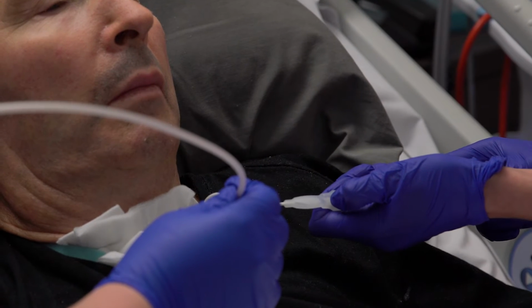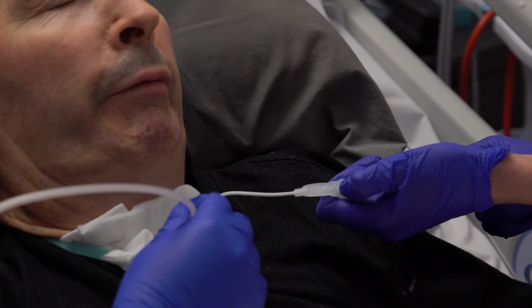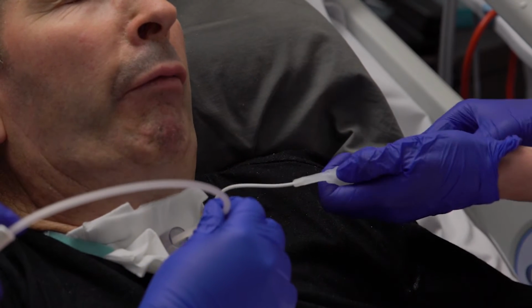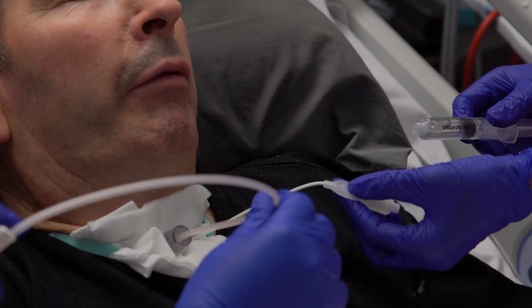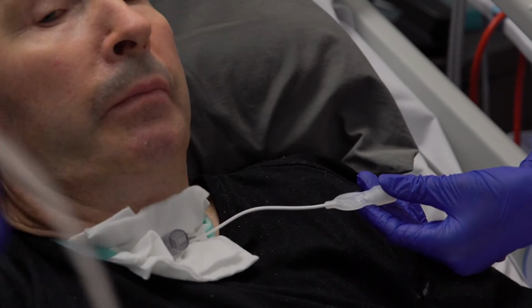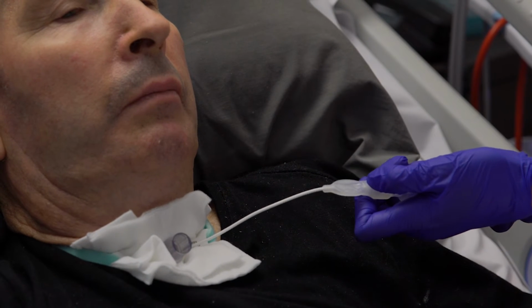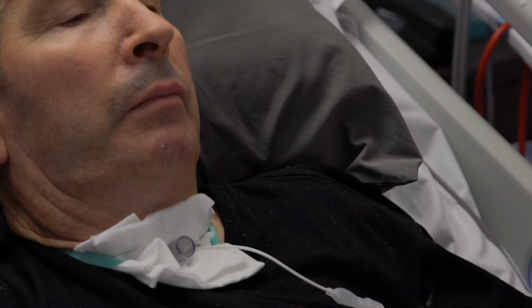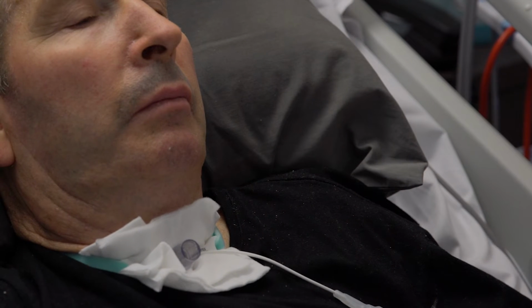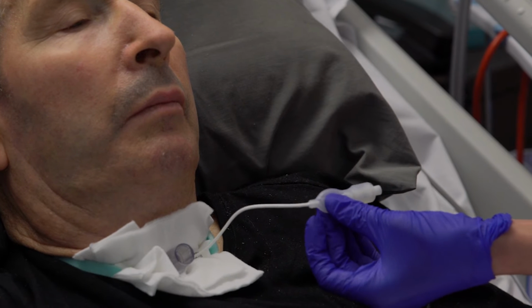Completely deflate the cuff and suction simultaneously via the tracheostomy. The cuff must be fully deflated when using a PMV. Check the pilot balloon to ensure the cuff is completely deflated.